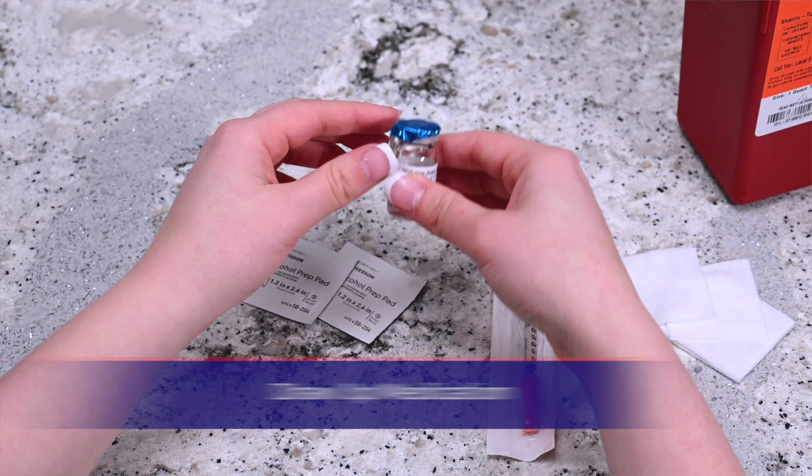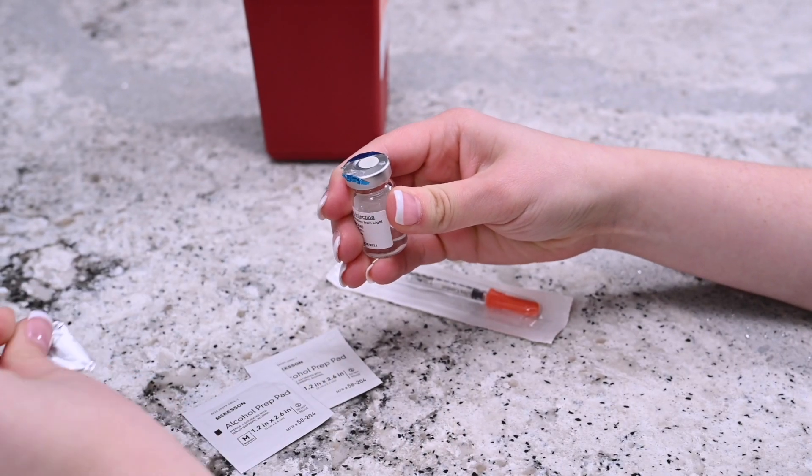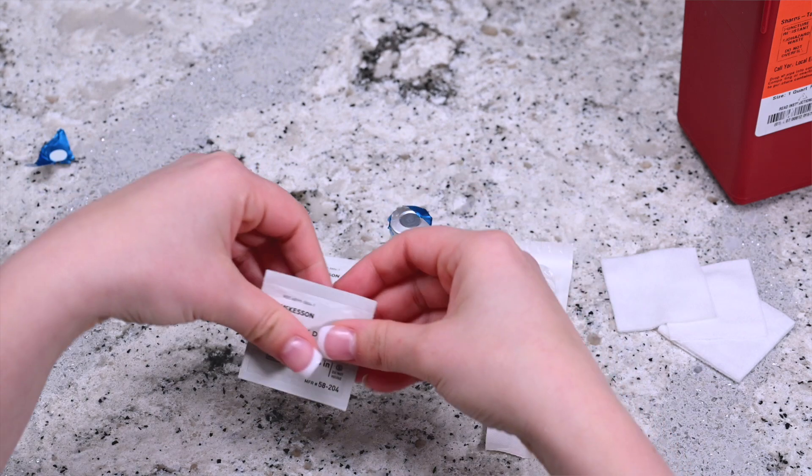Low-dose HCG is a compound medication that may come in a clear vial and must be discarded 28 days from opening. Remove the cap from the vial of low-dose HCG and disinfect by wiping the top with an alcohol prep wipe.